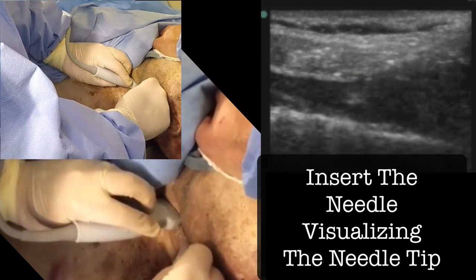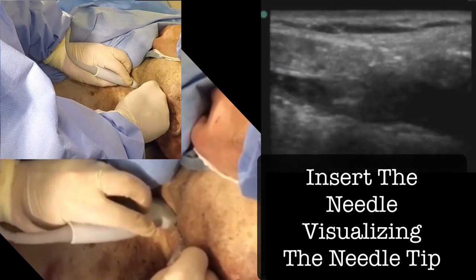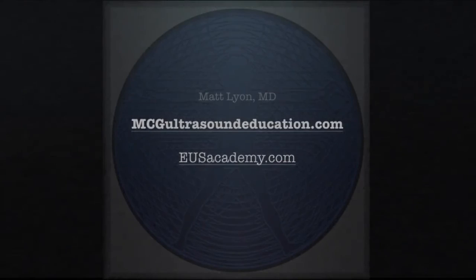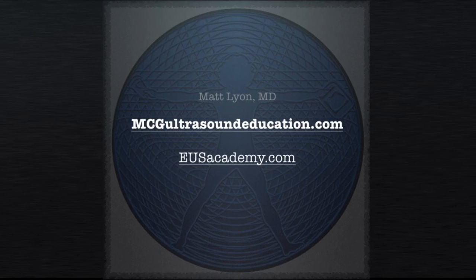This mixed technique is the preferred method of using ultrasound to visualize the needle for accessing a central vein. It eliminates misidentification of the vein while also reducing the risk of posterior wall penetration.